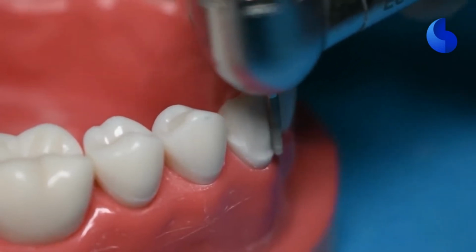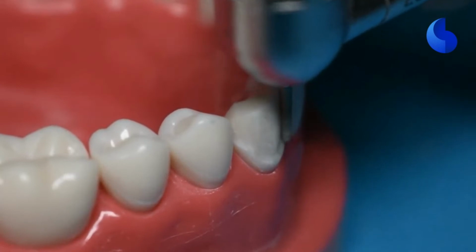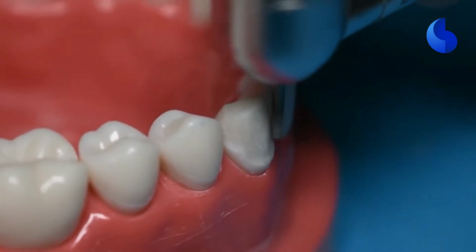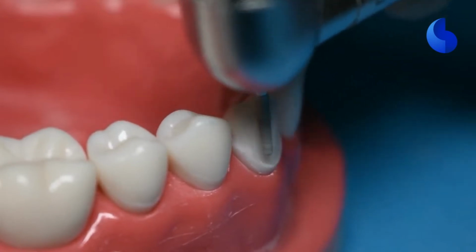Once you've completed your lingual reduction, you can go back to your facial surface, refine the preparation while moving your margin more gingivally, because remember, we gave ourselves some wiggle room, right? So that we can bring it down much later when we're refining the prep. That's the stage we are in right now.